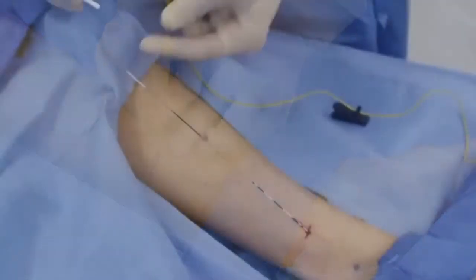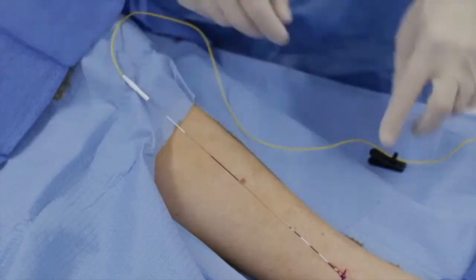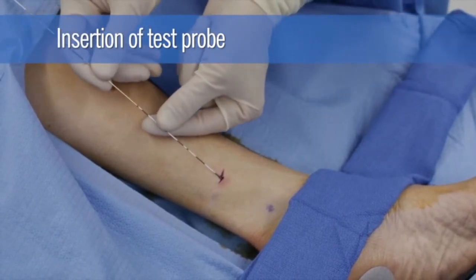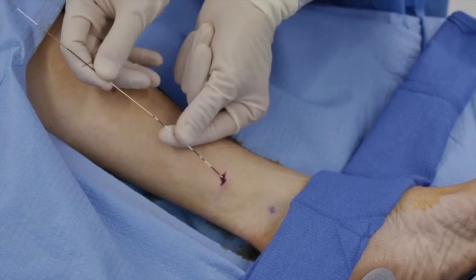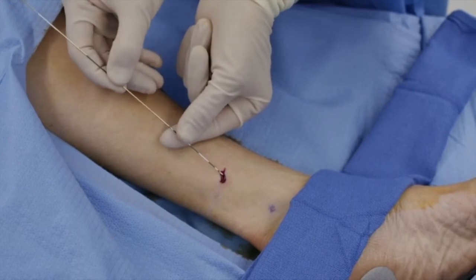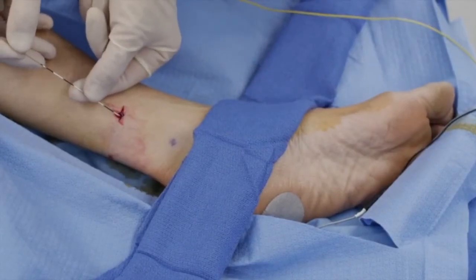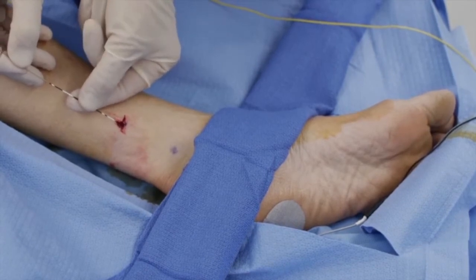The stimulation test probe is hooked up to the neurostimulator wire so that neurosensory response can help localize optimal lead position. The test probe is inserted with careful pressure at a 20 to 30 degree angle and will travel to a depth of approximately 1 cm beneath the skin as it is directed to the marked neurosensory site just superior and slightly posterior to the medial malleolus. The probe has to pierce the flexor retinaculum of the foot, which is a tough fascial layer, in order to come into appropriate proximity with the nerve.